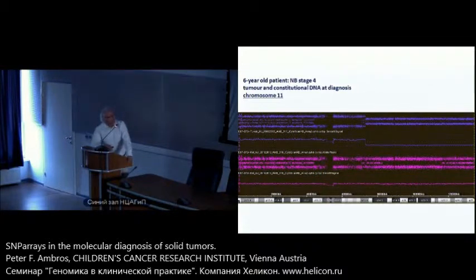This patient actually had a UPD. This is peripheral blood, an interstitial UPD, and acquired an 11q deletion actually in the UPD region. Therefore, I asked the speaker before if he finds an association between UPDs and segmental aberrations, what we call. I think this is an unexplored area.